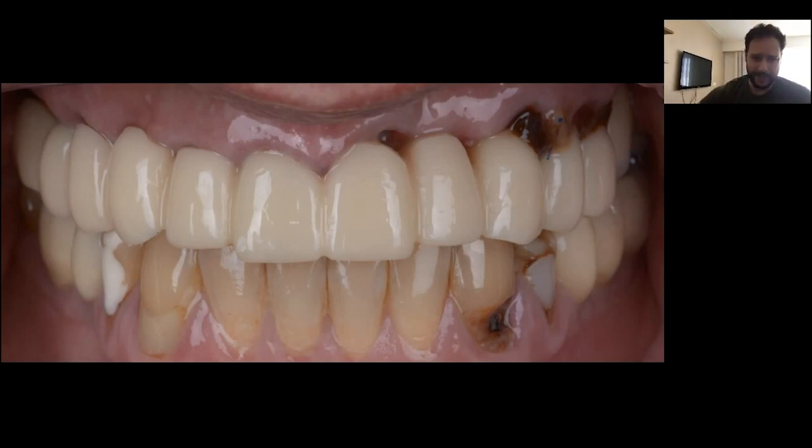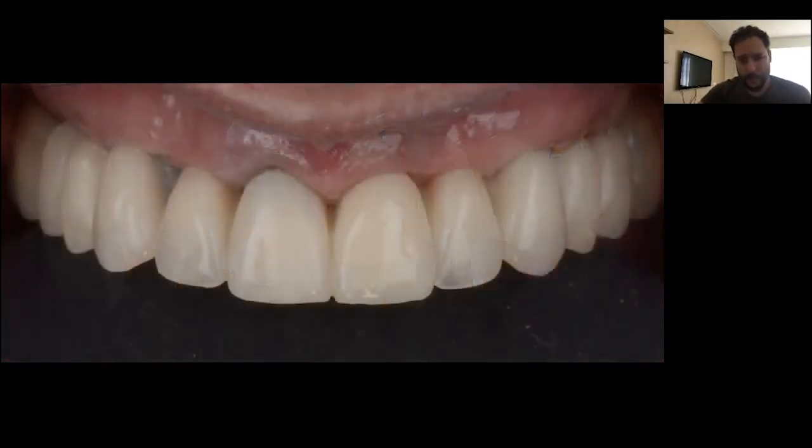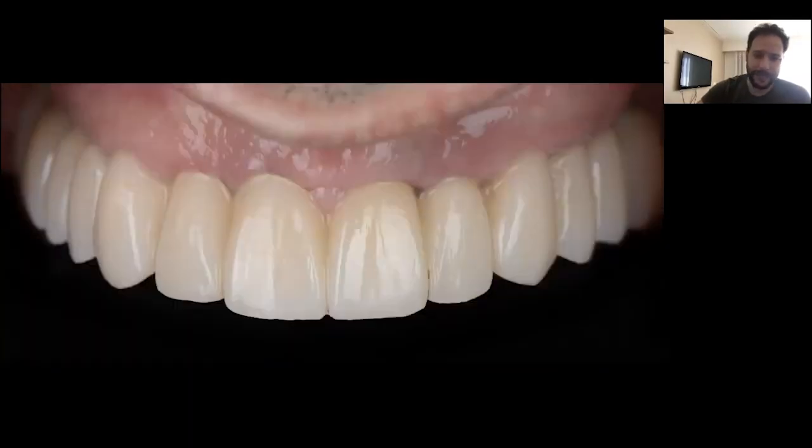We could not perform soft tissue augmentation on this case due to patient fatigue, so we did it afterward in a separate surgical step. After that soft tissue augmentation, we finalized the definitive bridge in zirconia for this case.